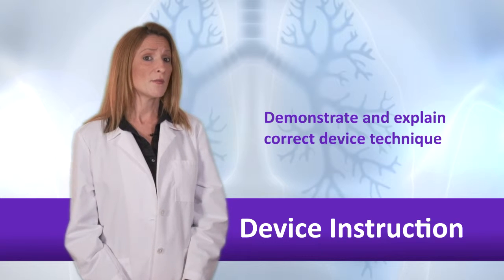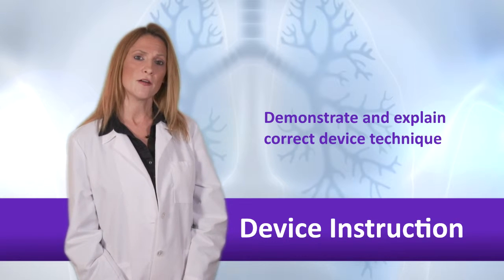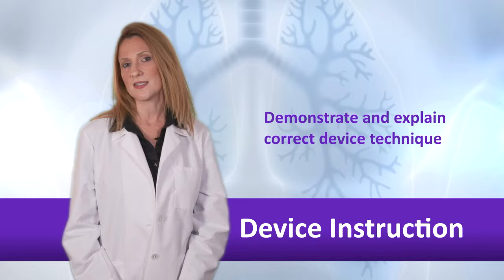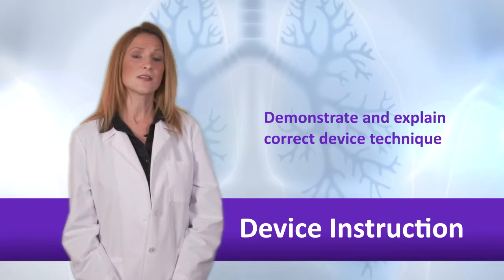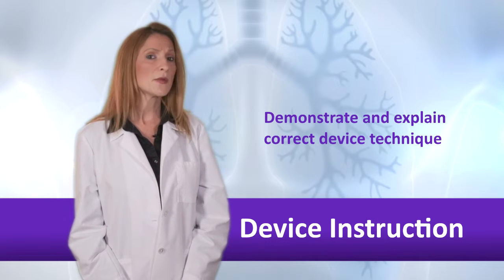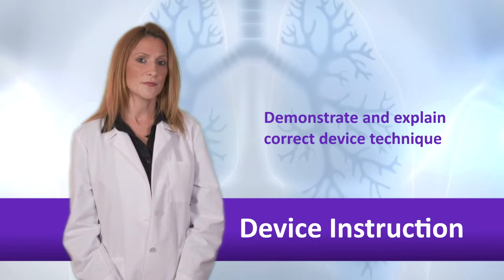Wait 1 minute between puffs. This gives the first puff time to work and the second puff gets deeper. Hold your breath for 10 seconds so the medicine settles in your lungs. Otherwise, you might be blowing the medicine right back out.